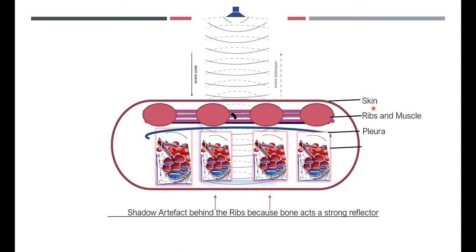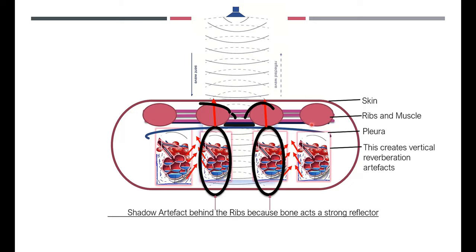So classically what you can see is sound waves coming through over here, and the rib shadows, obviously, from our perspective, coming in the way, reflecting sound waves back. So the rib shadows reflecting sound waves back mean these areas of the lung can't be seen, and that creates your acoustic shadow. But this area of the lung, which has tissue in it, will be seen. And clearly, these acoustic shadows will create dark areas, whereas this tissue shadow will create the ability to see lung. You will see the pleural margin with these ribs seen as this. And this is classically what we call the bat wing appearance of normal lung.